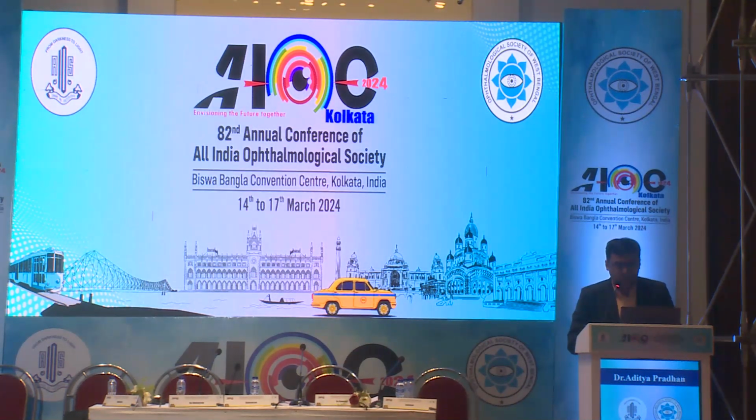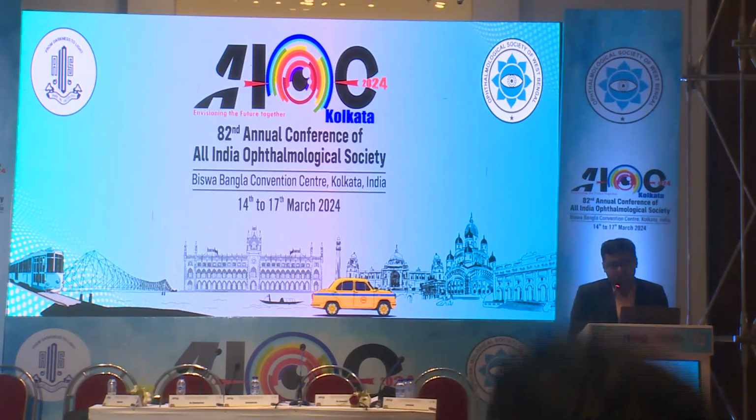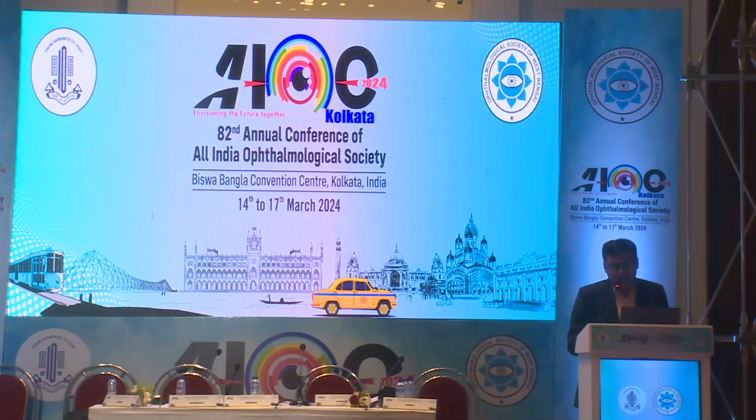Now, till now we have been discussing eyes which are essentially blind either due to trauma or post intraocular surgery, or they are congenitally blind. So now in this next presentation I aim to present something in which madam has showed the indications, that is reduction of glare and photophobia is one of the objectives why we do tattooing. But obviously one has to be very careful. So I will just go into slideshow.